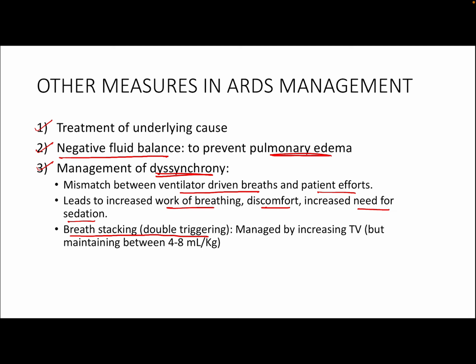And that can be because the ventilator is not supplying enough tidal volume in the first breath. So the patient requires more air, so he initiates a second breath too soon. And that is why one way of managing this double triggering or breath stacking is by increasing the tidal volume, so the patient does not need to initiate a second breath too soon.